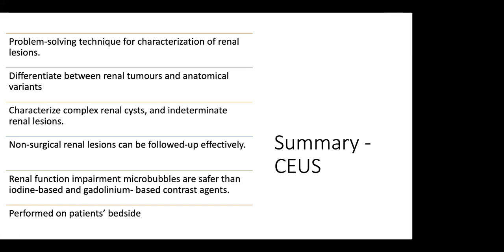Now, in terms of formal report, for example, if I send a patient nowadays to the radiology department for imaging, I will get a formal report, but maybe the imaging is not so friendly. I need a computer and a CD-ROM to run the software to see everything. We are in the generation that likes to see the renal masses on our own, for example, a CT scan.